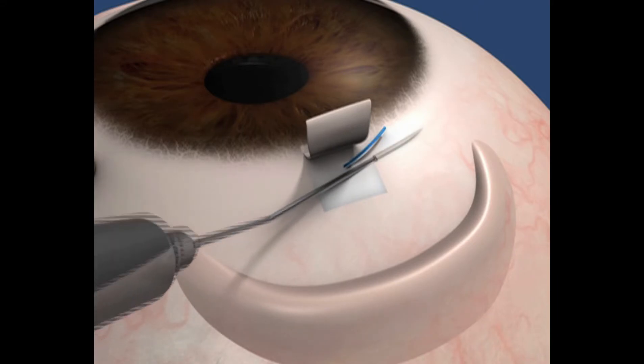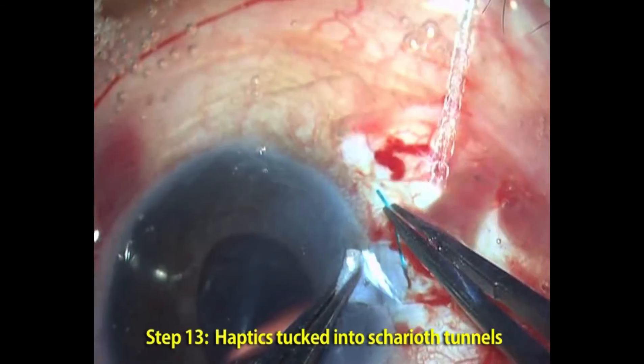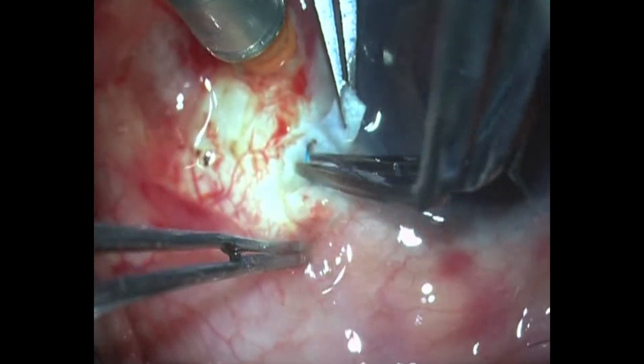We call these intrascleral pockets Gabor Chariots intrascleral tunnels. Into these tunnels, the haptics are tucked inside one after the other by flexing the haptic, taking it back, and then bringing it forward and tucking it inside.